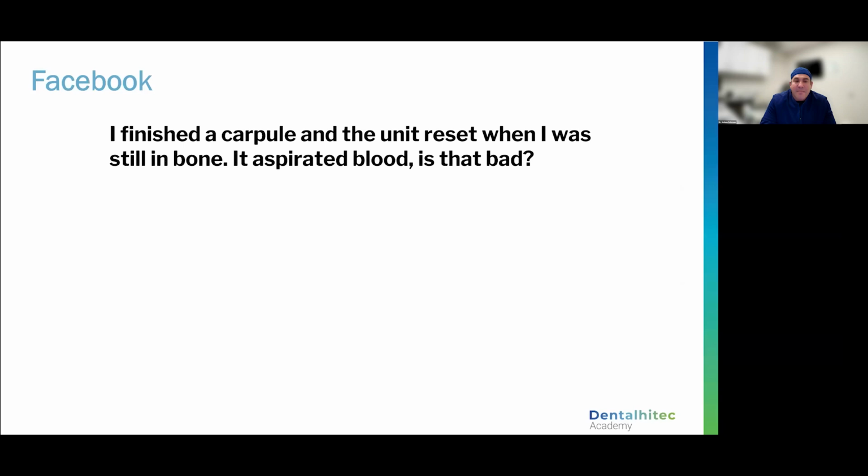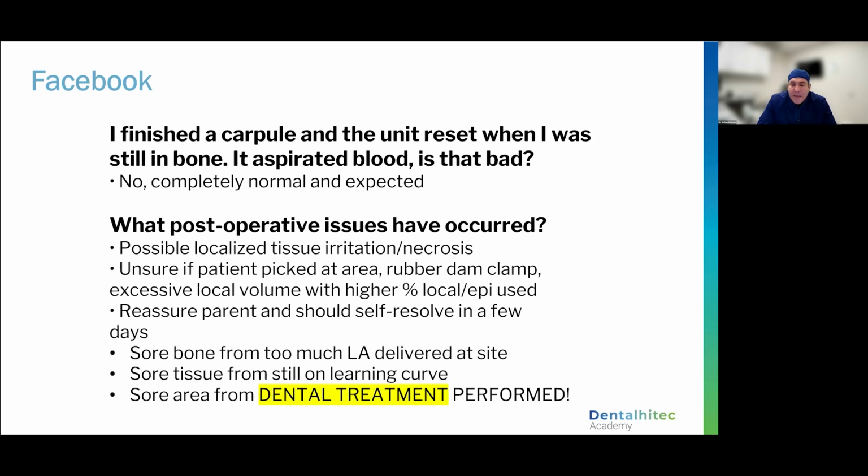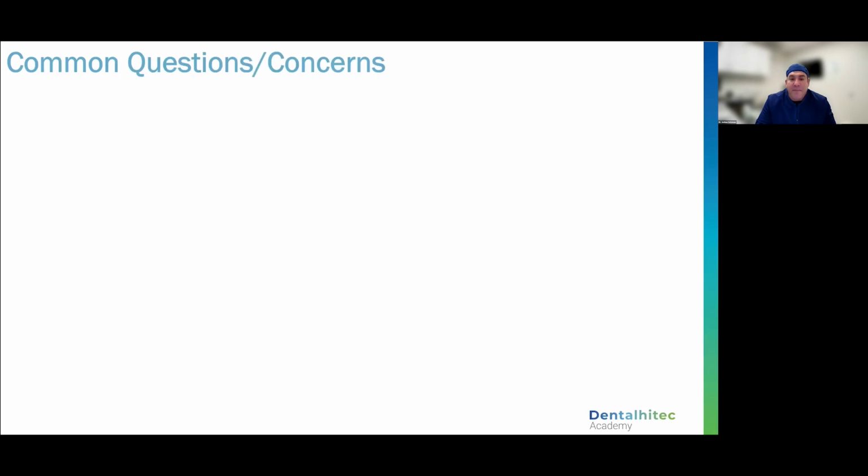Okay. I finished a carpule and the unit reset when I was still in bone. It's aspirating. Is that bad? No. Just remember you are passing through an area with a lot of blood vessels and bone, and you may have a little bit of blood inside that aspirated carpule. Totally normal. As for post-operative pain, just remember it shouldn't be much different than what you're doing now if you're not using these units, and you may want to think about giving OTC pain medication before the appointment.